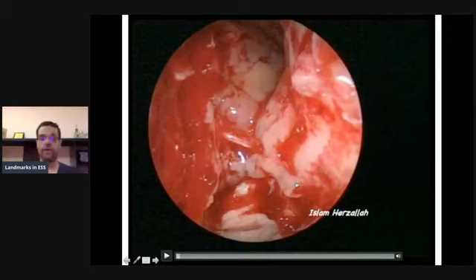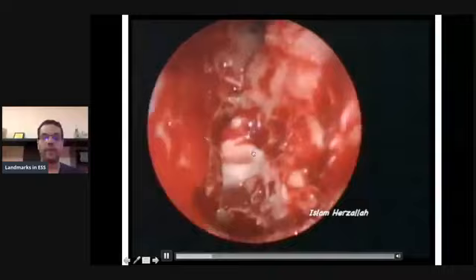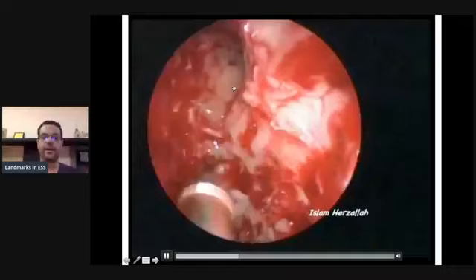So that's the left side. That's the posterior ethmoid artery, also dehiscent, very clearly appearing in the field. And then you have the skull base between the posterior and the anterior ethmoid artery. And then you have the anterior ethmoid artery right there, just in the field. It's just in the field. You remove the polyps, it's in the middle of everything. And then you have the first fovea, the space between the anterior ethmoid artery right there and the posterior table of the frontal.